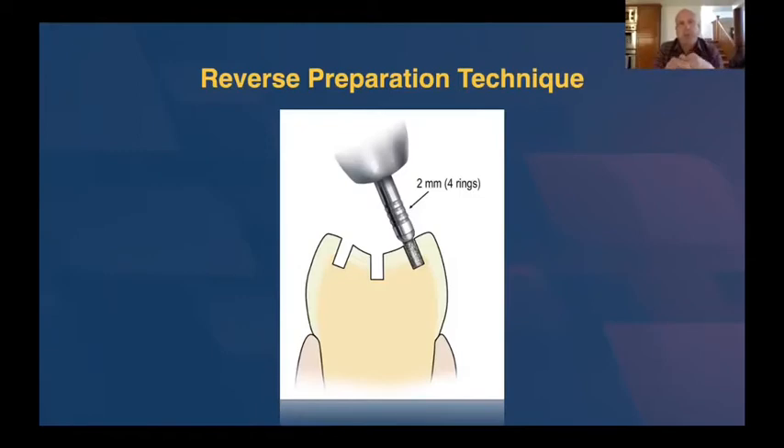When we're using these depth cutting burrs, one principle we want to keep in mind is that the burr is always perpendicular to the tooth surface — at a 90 degree angle to the tooth surface itself. Whether you're making a depth cut in the central groove where the burr would be straight up and down, or slanted to match the angle of the occlusal surface, or into the cusp tip itself. The nice thing about these depth cutting burrs, as opposed to a 330 burr, is that there's a shoulder on the burr. When you push the burr into the tooth, it stops — in this case at 2 millimeters — and won't go any deeper, which is a very accurate way to make a depth cut.